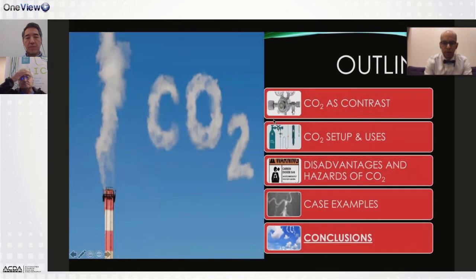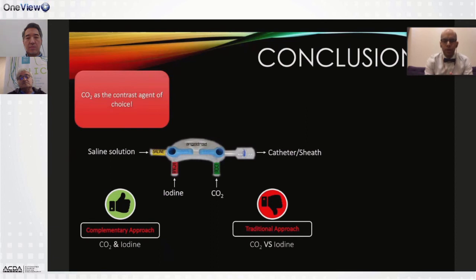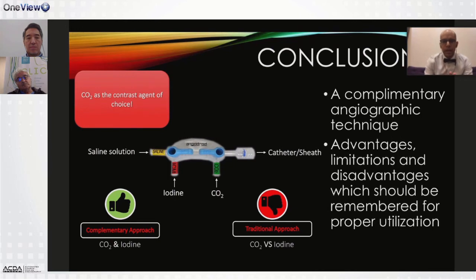So in conclusion, just to finish, I'm sorry I took maybe a couple of minutes extra from your time. Remember, CO2 is a complementary agent nowadays, I think, and it's not something of CO2 versus contrast. It has its advantages, its limitations. It is a technique you need to learn. You need to understand how to use it before you use it.